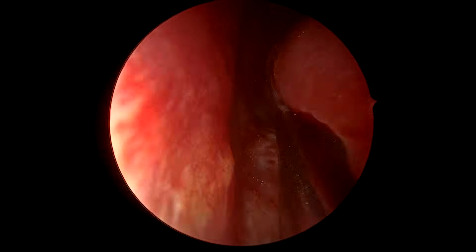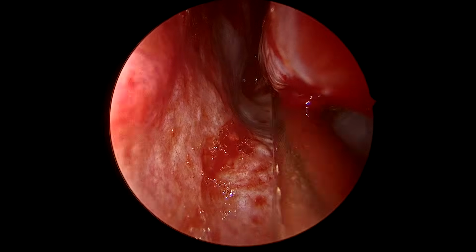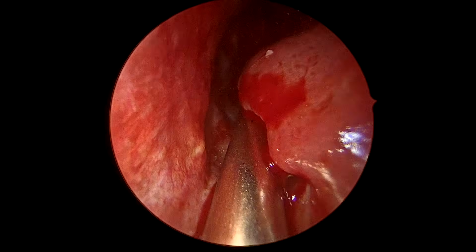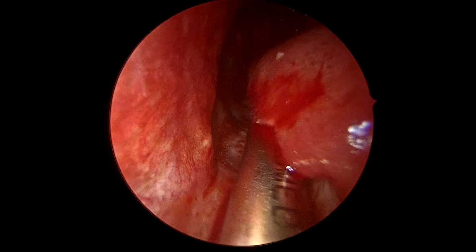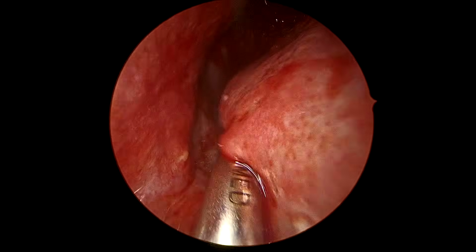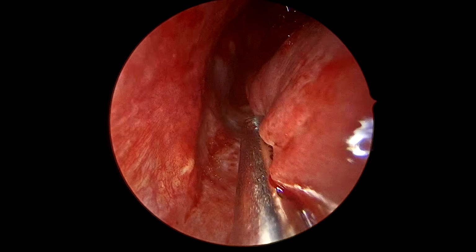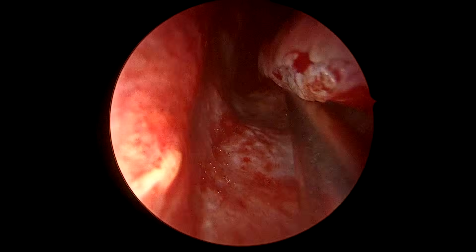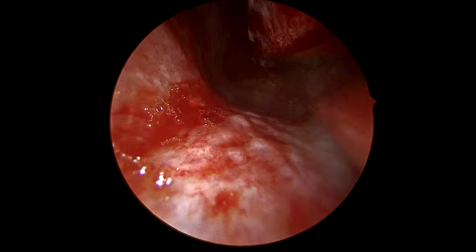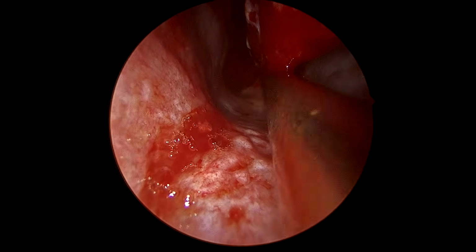Since this patient also complained of nasal obstruction, on and off, previous to this occurrence of the mass, and since he was under general anesthesia anyway, I did a partial turbinoplasty also, so that the nasal passage is properly open, and this person should not have nasal obstruction on the left side after this surgery. So this is the inferior turbinoplasty. I am taking off the polypoidal inferior aspect of the inferior turbinate.